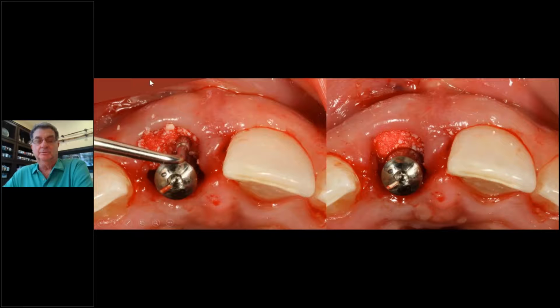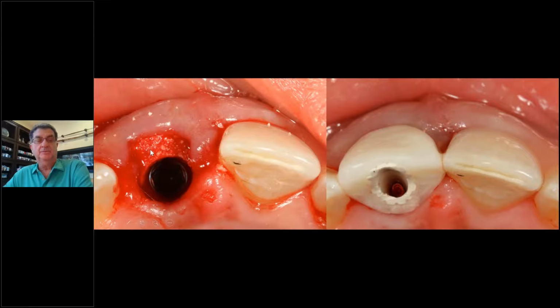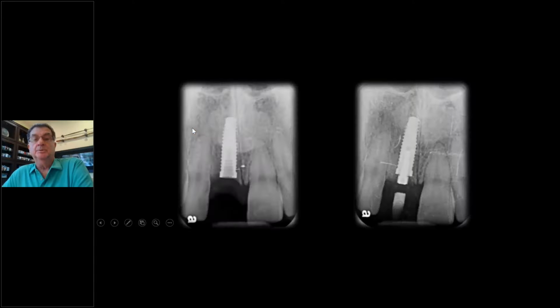Beautiful contour. Really, look at all the distance now I have. Gorgeous, gorgeous. Very nice. All the thickness. Place it in, let it solidify about 3 to 4 minutes, let it clot a little. Take it out and then put the temporary on. It's already been pre-made out of occlusion. Place it in. This is the way the patient walks out. Put the graft in place and the implant in place. Here's the implant. Okay, the graft's in place.